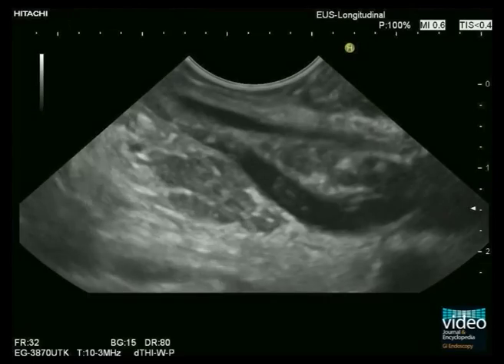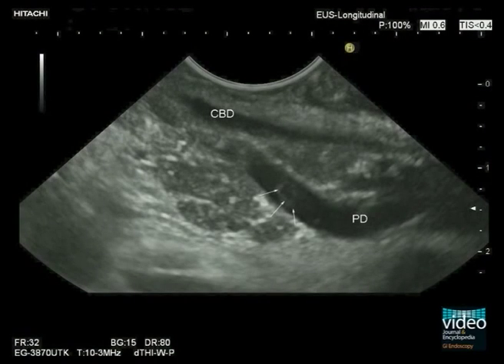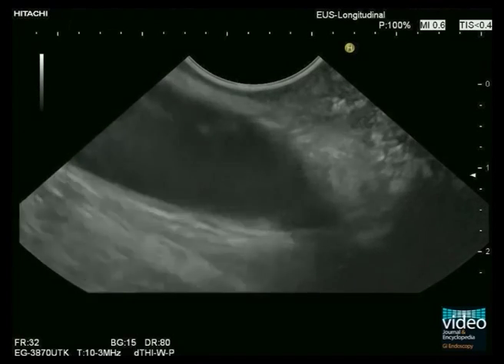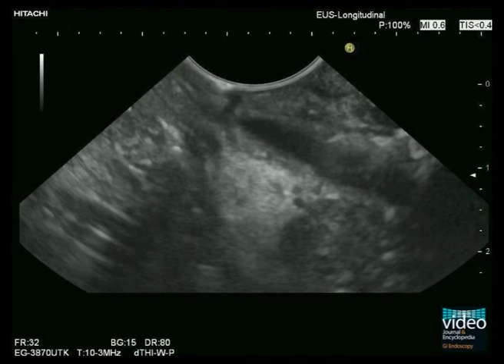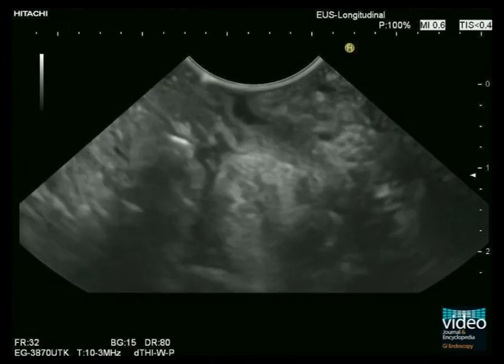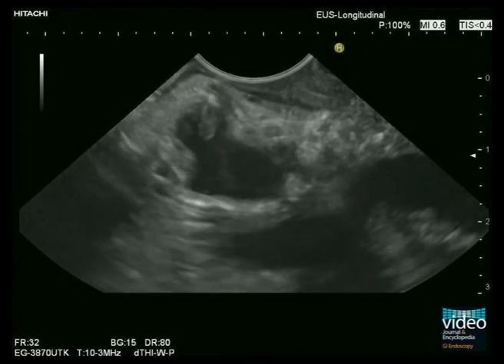Longitudinal endosonography first demonstrates a dilated pancreatic duct with some non-shadowing echogenic material. There is neither a stricture nor a stone of the distal pancreatic duct. Conversely, the orifice of the pancreatic duct is widely open. Slow withdrawal of the scope along the pancreatic duct shows further non-shadowing material as well as papillary protrusions within the irregular dilated pancreatic duct. Endoscopically, mucus is shown to leave the papilla.